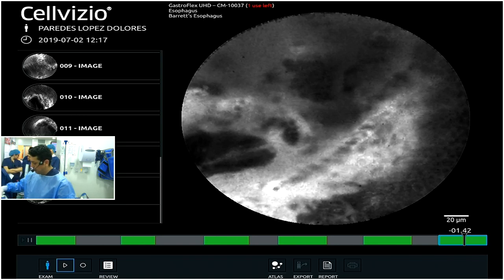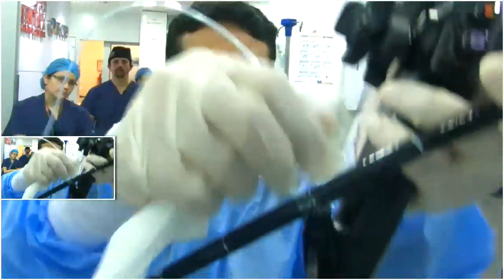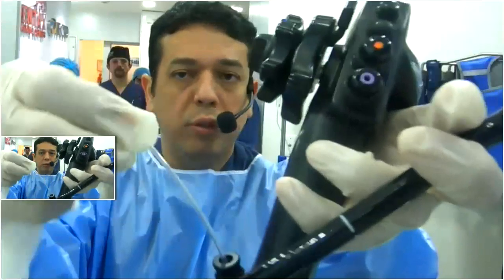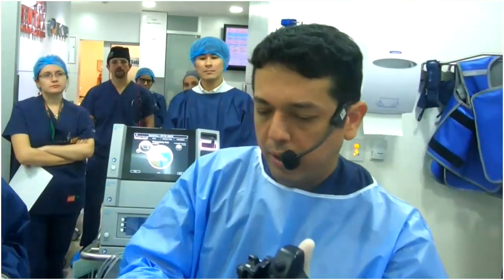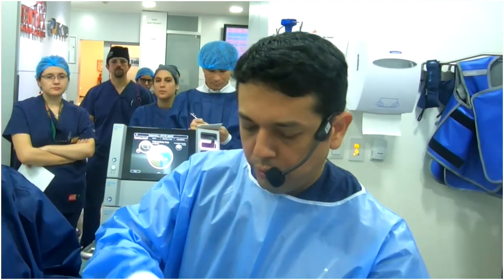So this is the kit of the Captivator. First we need to pass this. You don't need to remove the plastic. I don't know if you are looking here. You don't need to remove this plastic cover; you need to remove it after. So you pass through the channel.